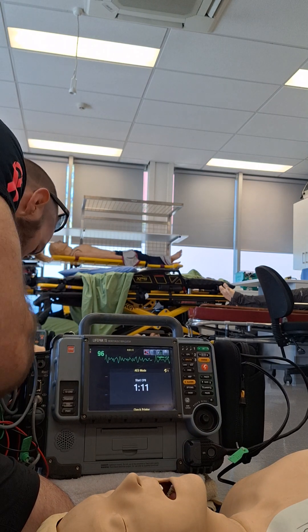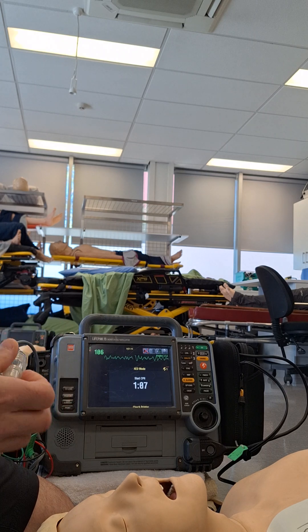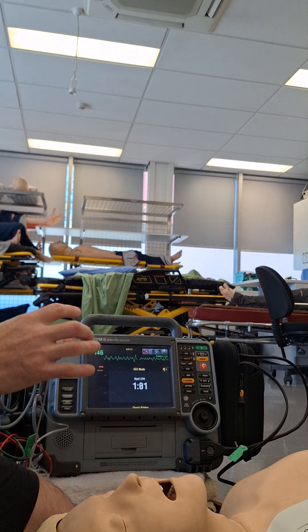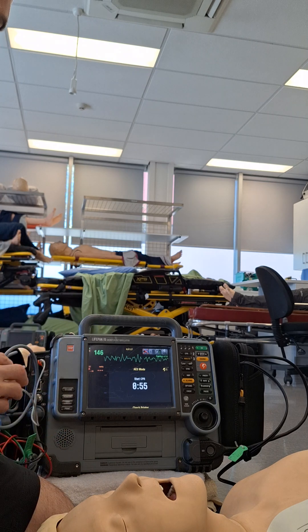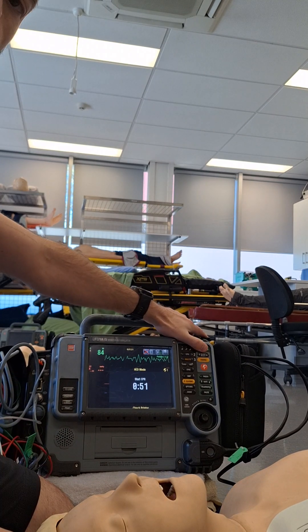For the end-tidal CO2, the probe lives on the left side of the monitor and it needs to be screwed into the CO2 port to activate the sensor and activate the probe. And we need to do that before we attach it to our LMA and our airway circuit. So that's the LifePak.